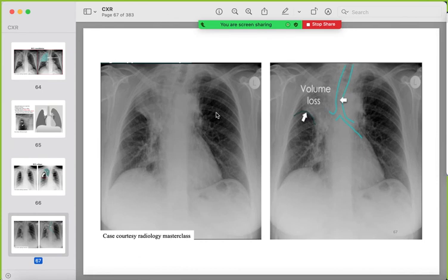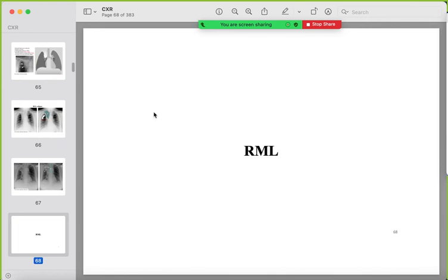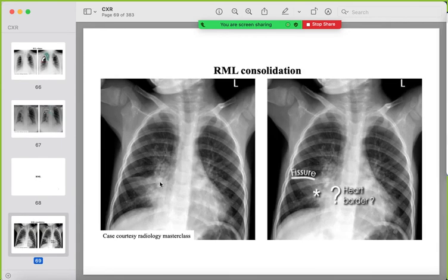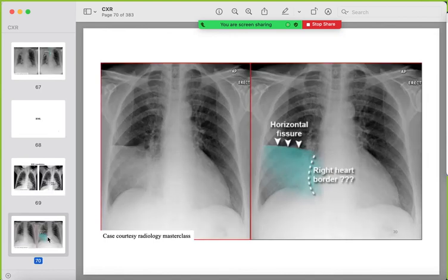In right upper lobe collapse, the trachea is shifted to the ipsilateral side. For right middle lobe collapse, the opacity is in contact with the right heart border — a triangular opacity — and the right heart border is lost (silhouette sign), while the right hemidiaphragm remains visible, confirming the right lower lobe is unaffected.